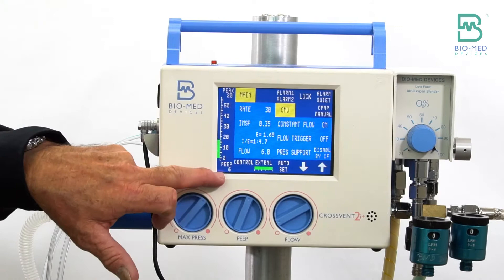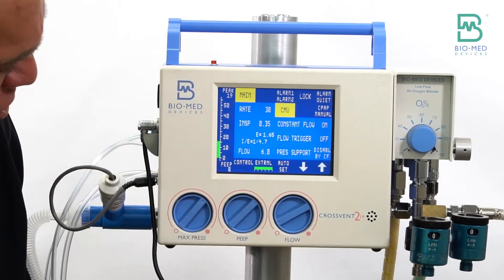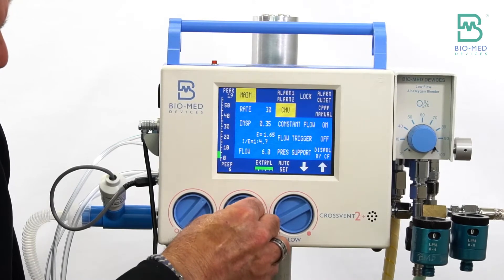PEEP is displayed down here in the bottom corner. As you turn that knob, you can increase or decrease your PEEP accordingly.